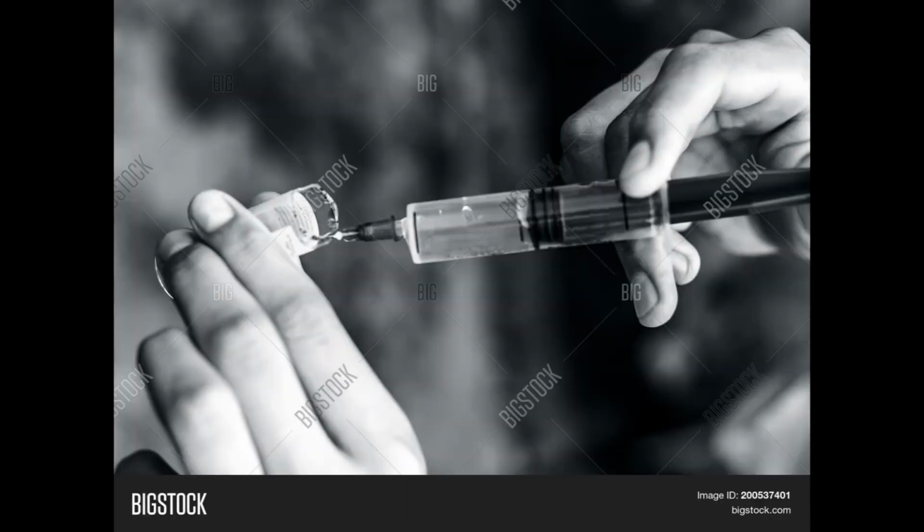To pull up the medication, you gently insert the needle into the ampule and aspirate the required content. Be sure to change your needle before administering medications to avoid discomfort from damage to the needle as the medication was withdrawn from the ampule.